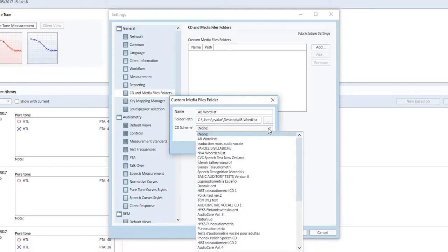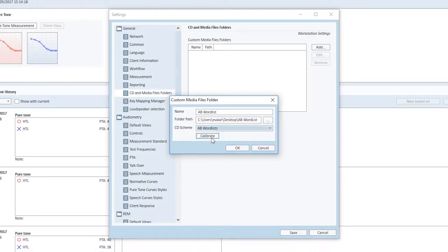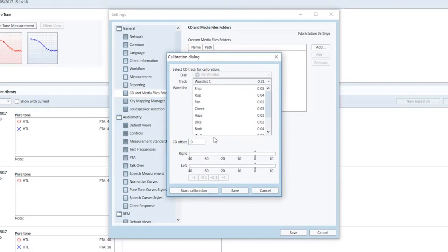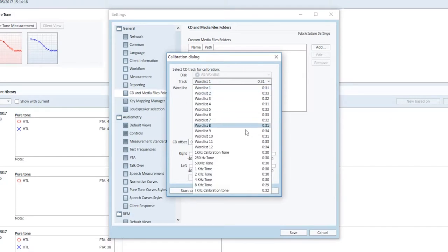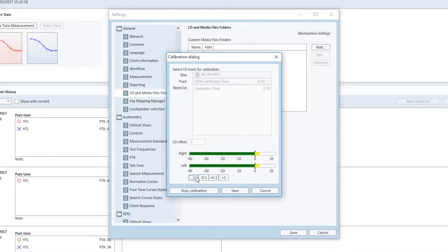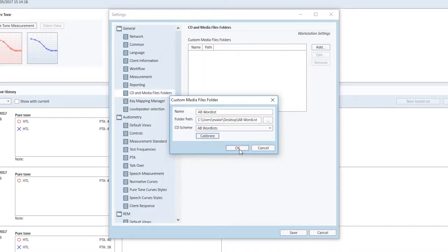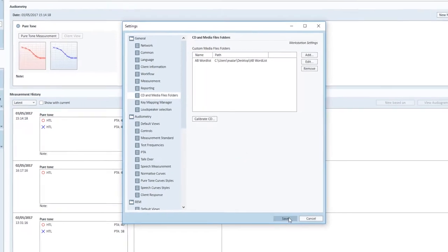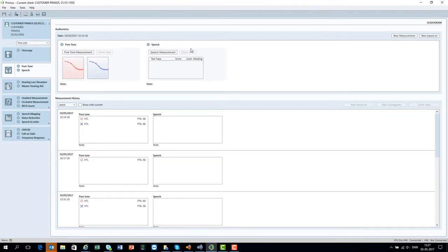From the settings box you can calibrate the media file. Pick the calibration tone in the calibration dialog box, start calibration, adjust the level to 0 dB and click Save. Go to the Primus speech measurement module and select the AB Wordlist media file.